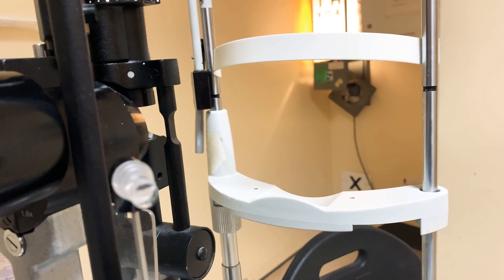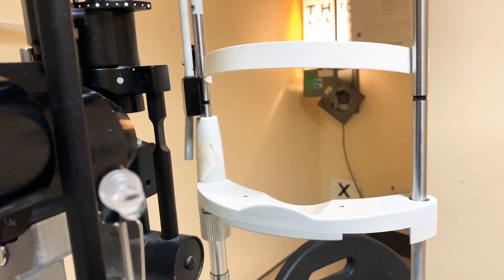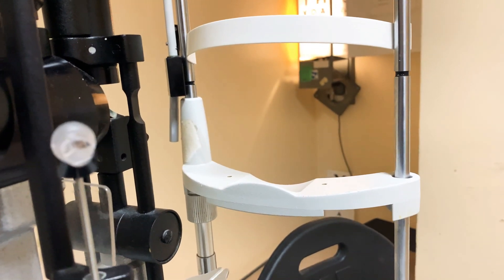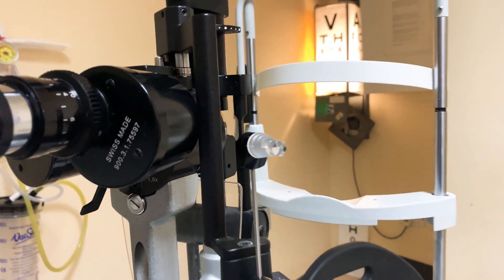When you're using fluorescein dye and want to look at the cornea generally — checking for any obvious areas of fluorescein uptake, corneal abrasion, or corneal ulcers — you probably want a wide beam with high brightness and low magnification.